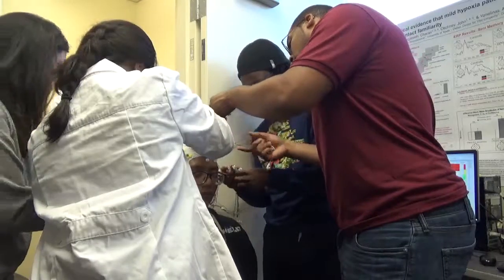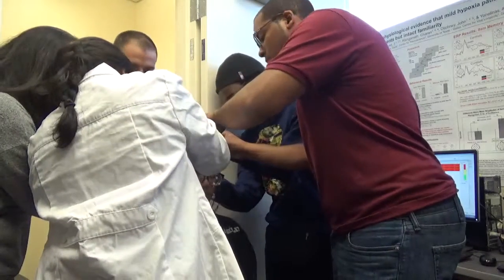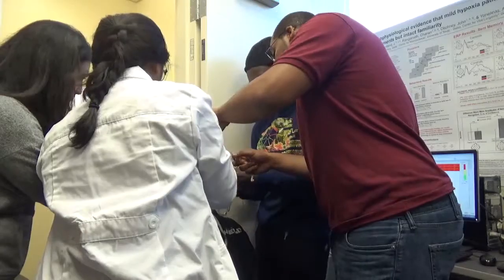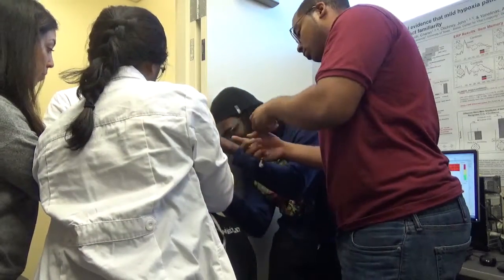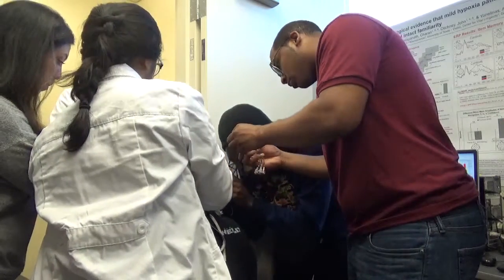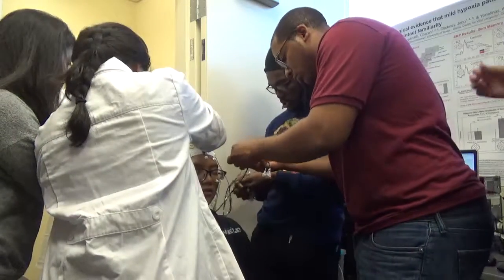And so here's another little tip and trick. Yeah, that'll fall off sometimes. Make sure that's clipped down there. You gotta put this back on. So one way to do this is, again, use a two-hand approach, just like when we filled the gel. I'm right-handed, so I use my right hand. So use your left hand to hold the plastic capsule in place. If you guys can't see, you can rotate through and see what we're doing. There's no gel in it. And the right hand to actually then plug it in. Put gel in there a little bit. Don't worry too much about that.